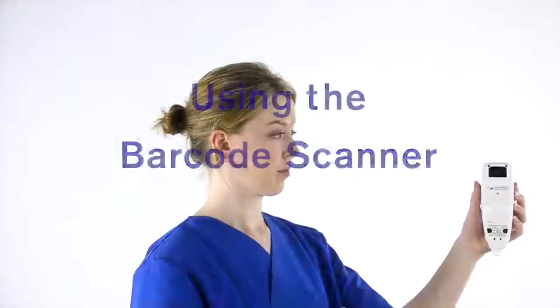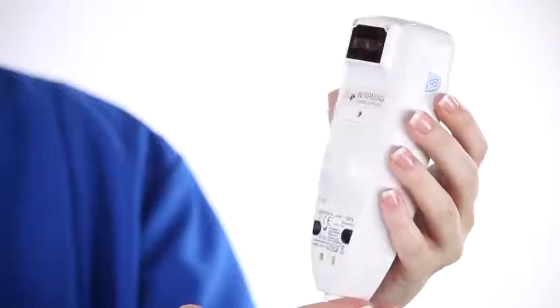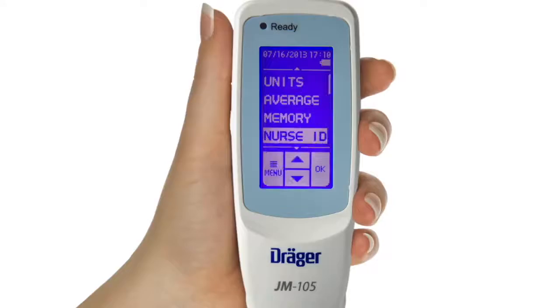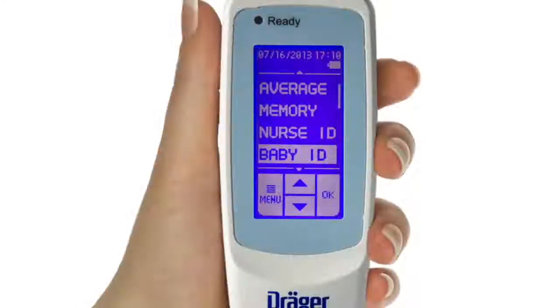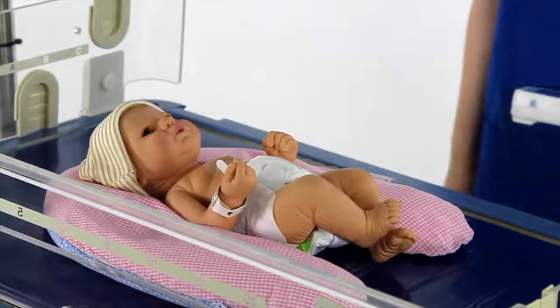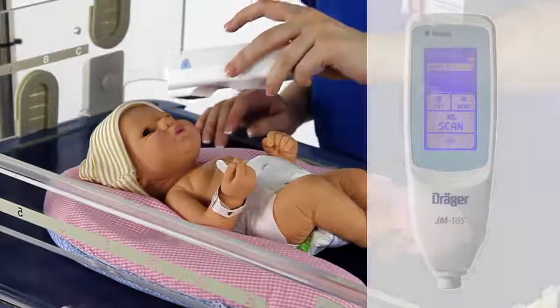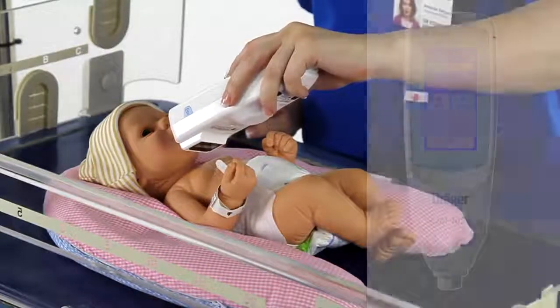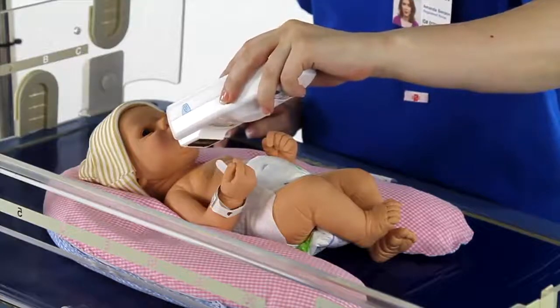We will now demonstrate how to use the barcode scanner for those whose JM105 has this optional feature. To use the barcode scanner, make sure that you have configured the JM105 nurse and/or baby ID for barcode. To scan the baby's ID, hold the barcode reader in a direct line with the barcode on the baby's armband and press Scan. The barcode reader will emit a red light that reads the barcode.